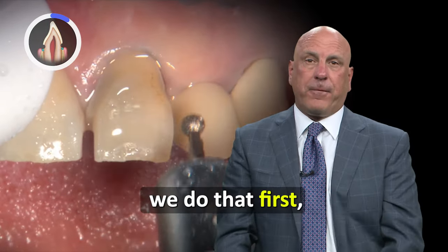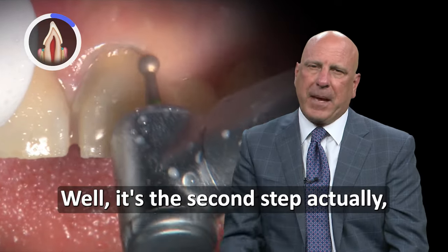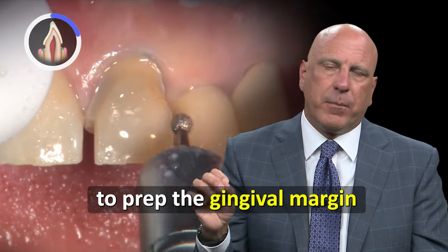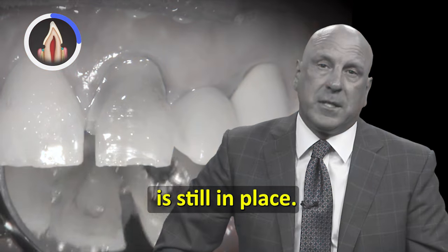In my technique we do that first — we actually prep the gingival margin right off the bat. It is way easier to prep the gingival margin on a crown prep while the rest of the hard structure of the tooth is still in place.